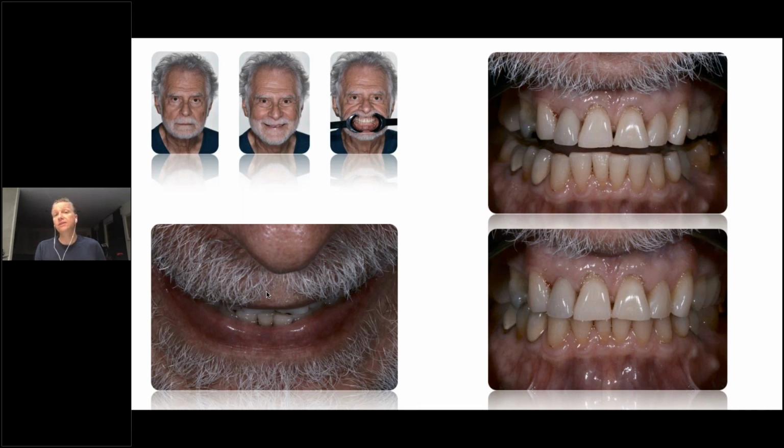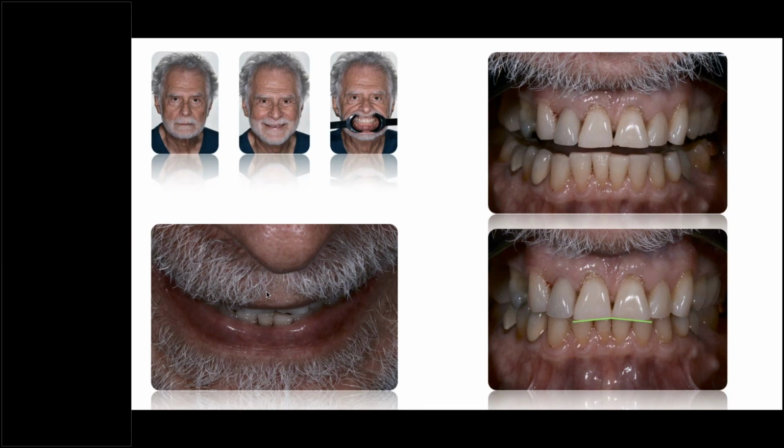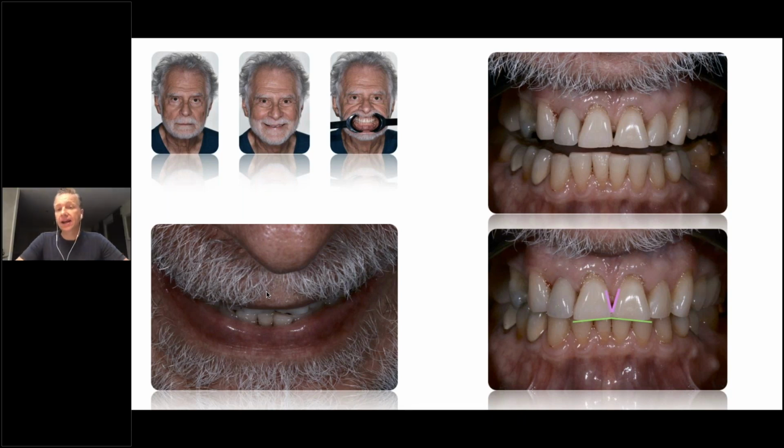And I would like to see some retracted close-ups so that I can also evaluate the teeth themselves. Usually I like to see a rest or a slight bite opening and a closed centric occlusion picture. Then, on the right, I can start evaluating that tooth situation, the intraoral situation, and also talk to the patient.